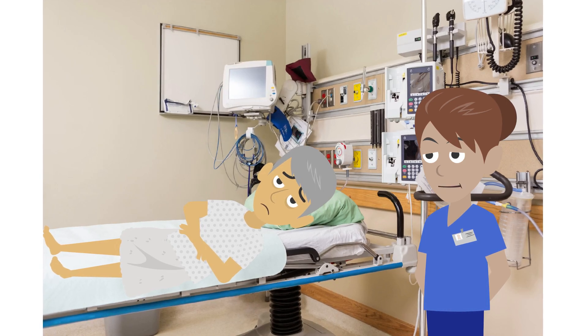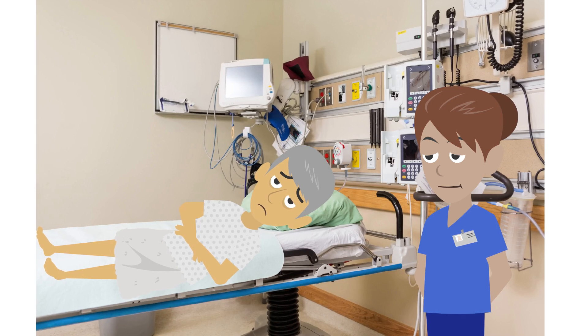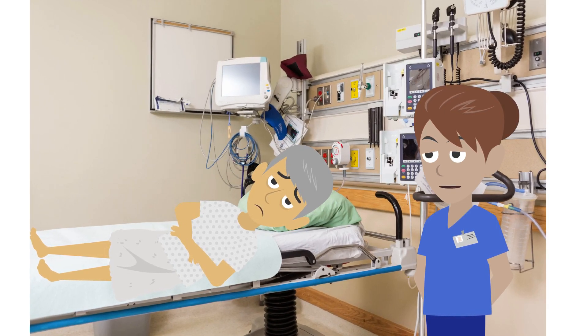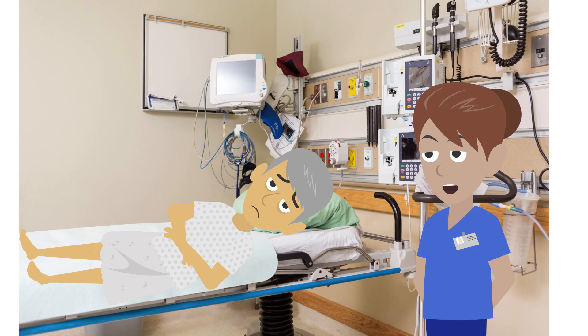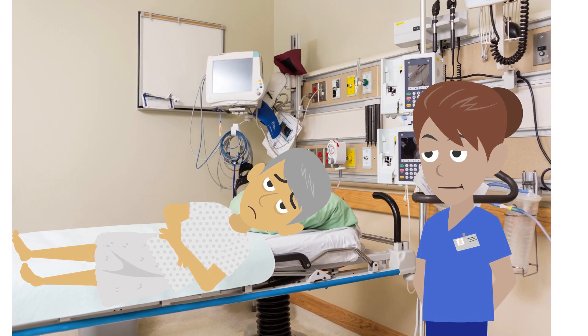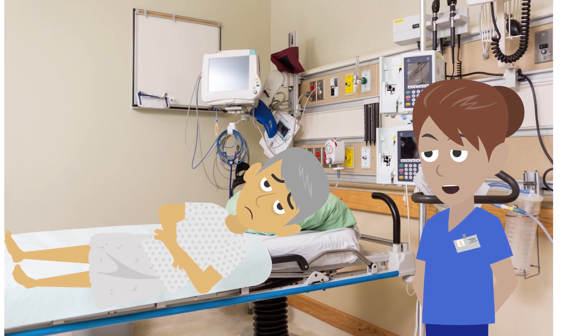Hi, I'm Miriam. I'm one of the nurses in the unit. I need to insert a feeding tube through your nose into your stomach so you can start having liquid feeds. The tube will stay in place until your swallow reflex returns and it's safe for you to eat and drink normally again. I'll explain the procedure step by step with you so you know what to expect. Is that okay with you?